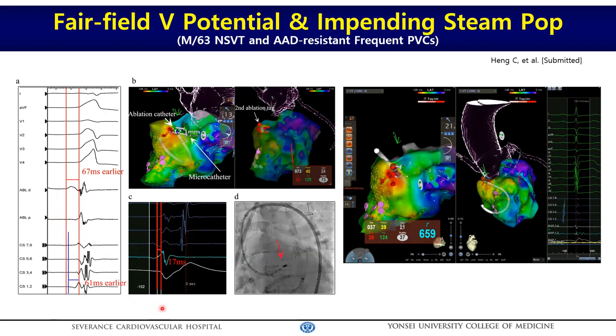As Jo reported, the endocardial unipolar activation was slower than bipolar activation, suggesting an intramural focus. Because the measured wall thickness was 12 millimeters, it was a typical intramural VA based on the Garcia algorithm, and the PVC disappeared within 5 seconds of 40-watt endocardial ablation.